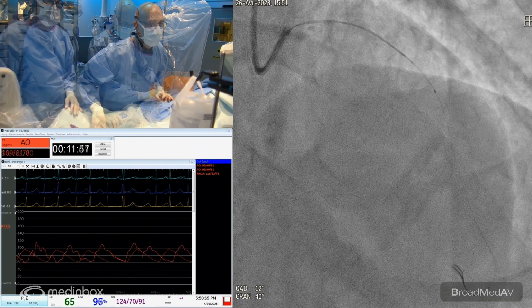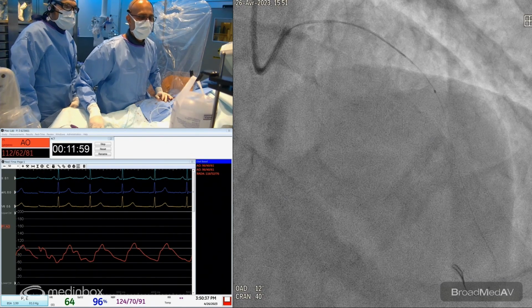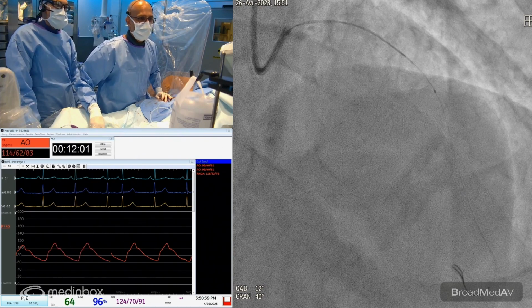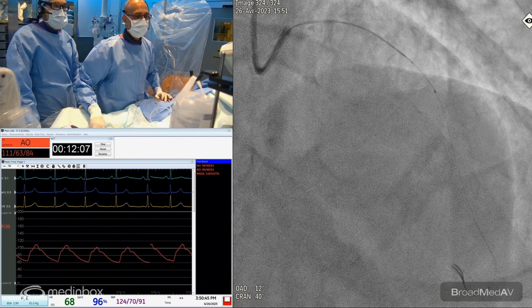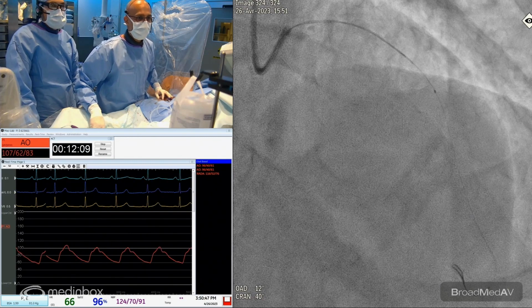They go off. So if we look at the IVUS to decide on the strategy, the options are either to perform atherectomy of the LAD, followed by wiring the circumflex, and then shockwave of the circumflex, versus just shockwave everywhere, which will maintain wire position.